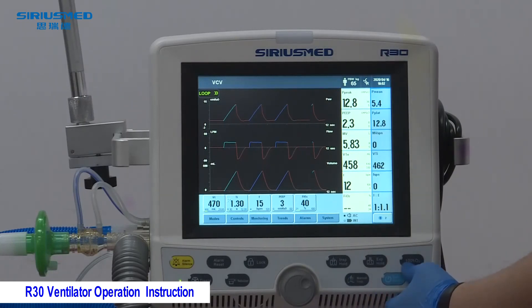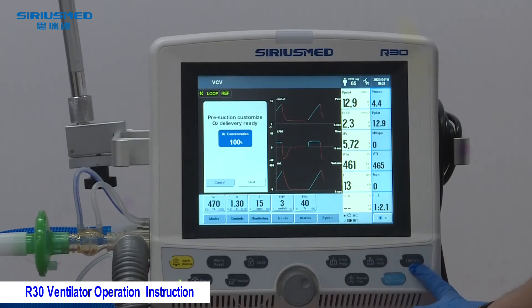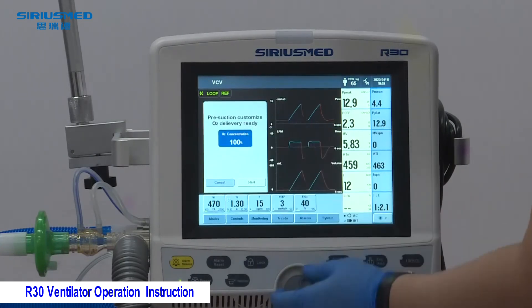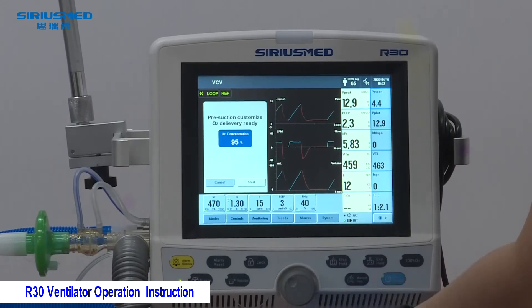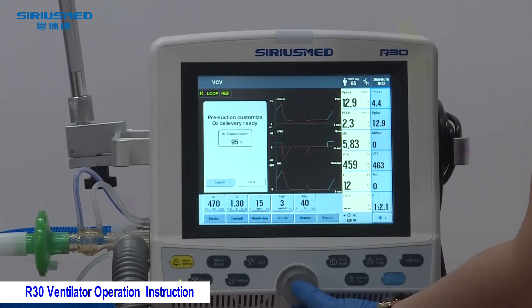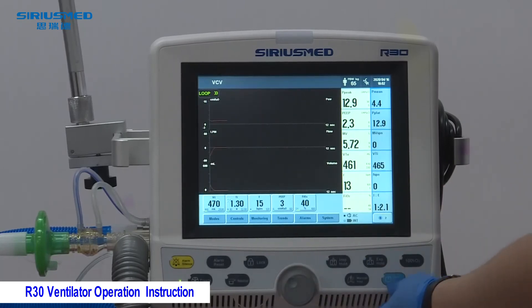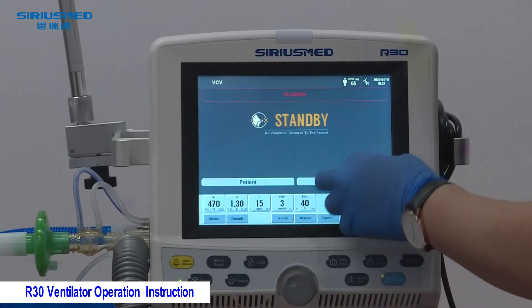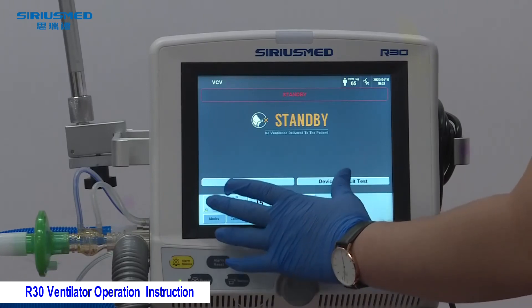The 100% Oxygen function is used before suctioning to protect the patient. You can adjust the oxygen percentage using the knob — don't forget to click to confirm and press Start. To put the machine into standby, press Standby and accept; the machine will return to the standby interface.